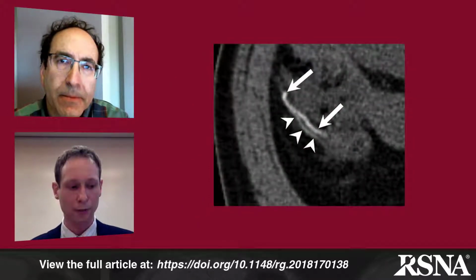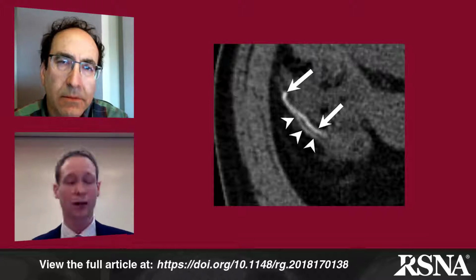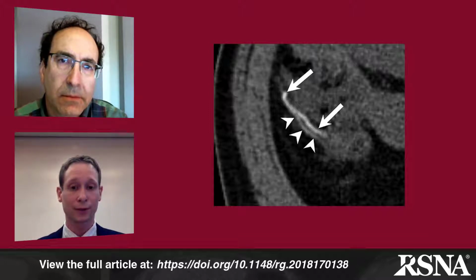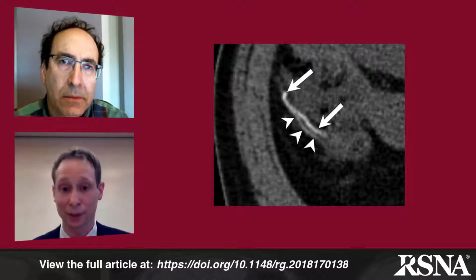Yep, so diverticulosis is by far the most common cause of bleeding in the colon. Vascular malformations are relatively less common, including AVMs. AVMs, though, are important because they can be missed at endoscopy. When we see them, they're most commonly in the cecum and in the rectum. And we're going to look at our arterial phase images to try to find these lesions.